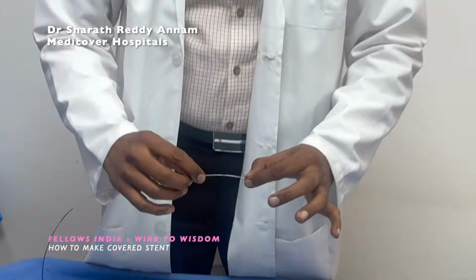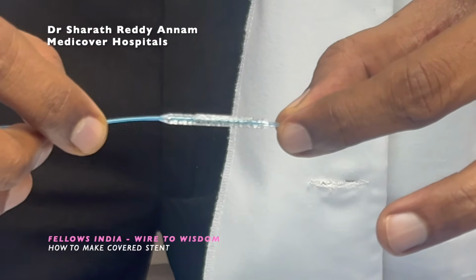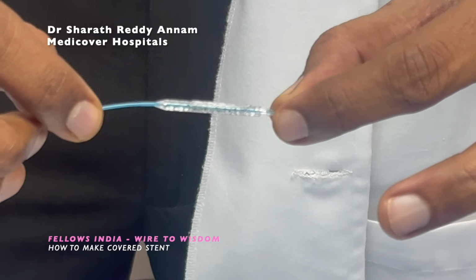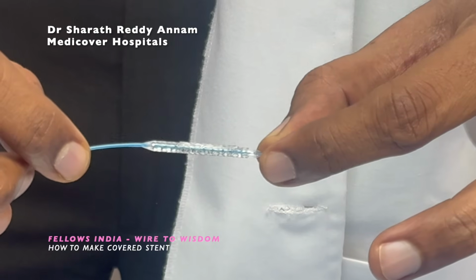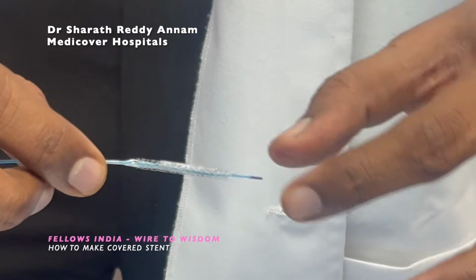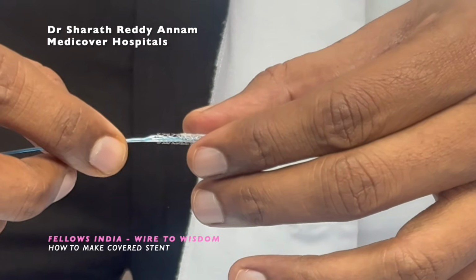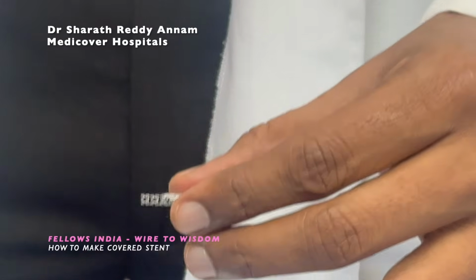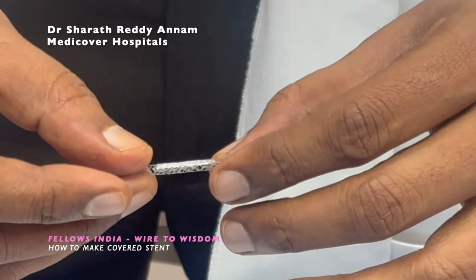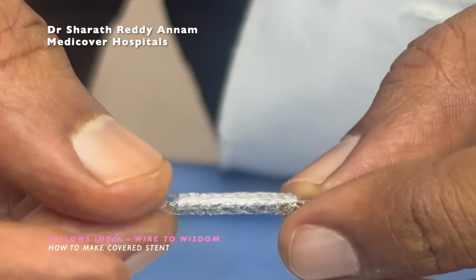So you deploy, and once it is deployed, you can come back. You can deflate the balloon and come out. Now you can see clearly it is covered.